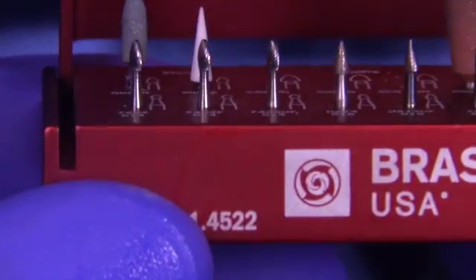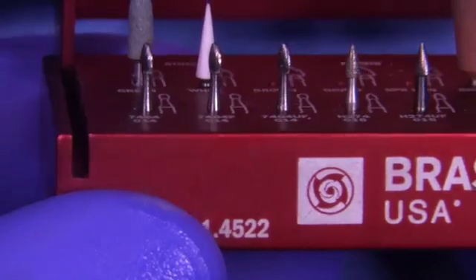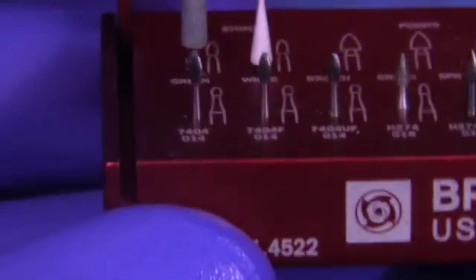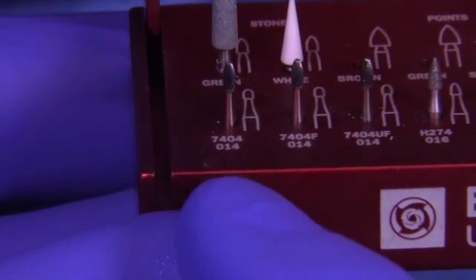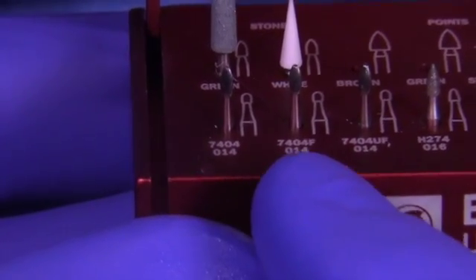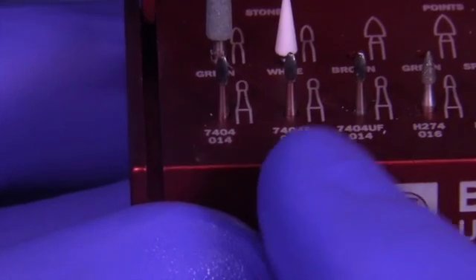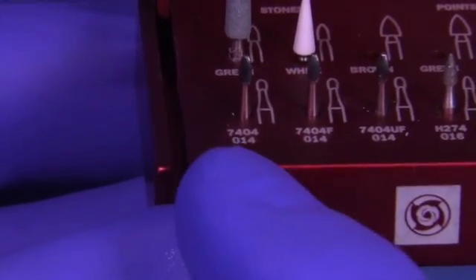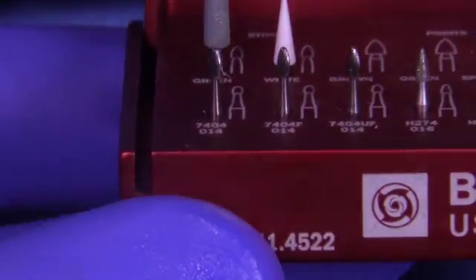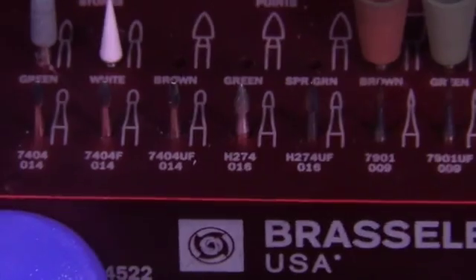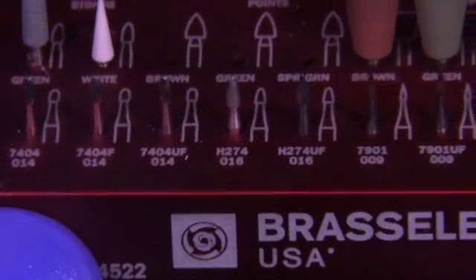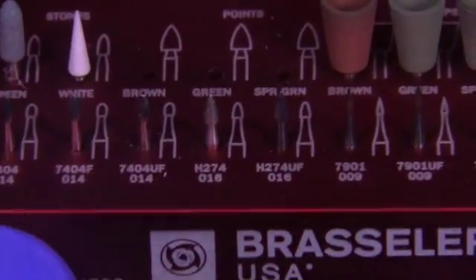Let's spend a couple seconds talking about this burr block. I love these 7404s—they're really helpful for adjusting occlusion. After you've done all this beautiful finishing and polishing, you want something that doesn't destroy this beautiful surface and you want to bring it back to the luster you had before.